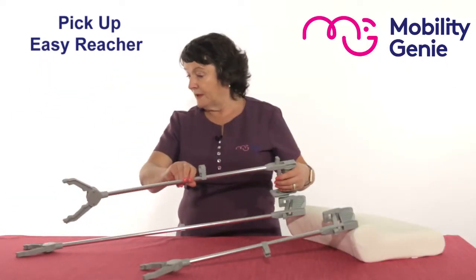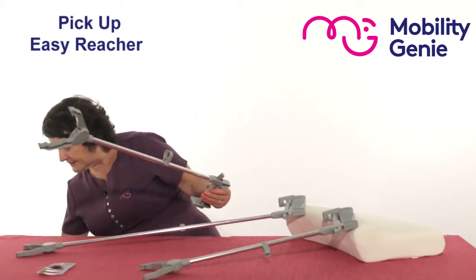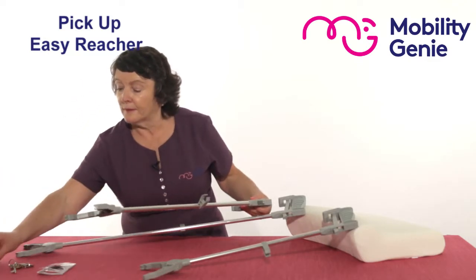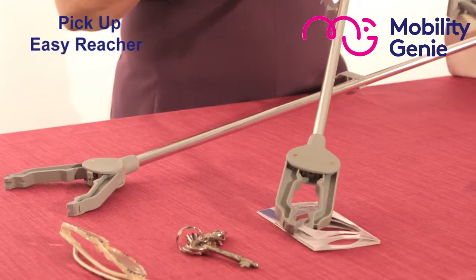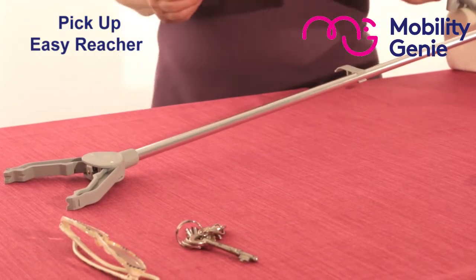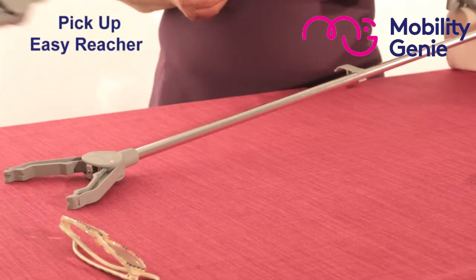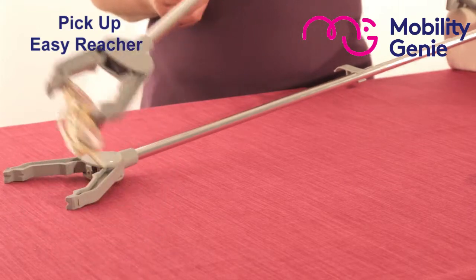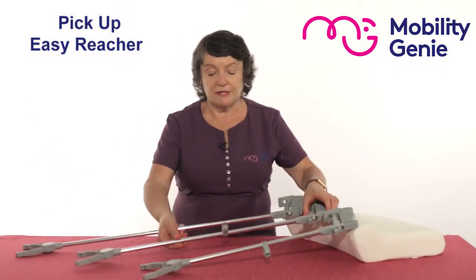So for example, if I was to put a leaflet, a set of keys, and my glasses and lift them like so, you can see how easy it is. So whatever it is that you drop on the floor, your easy reacher will allow you to pick it up.